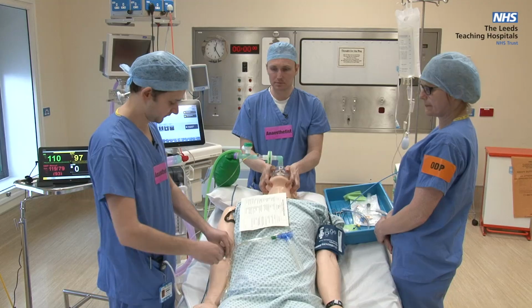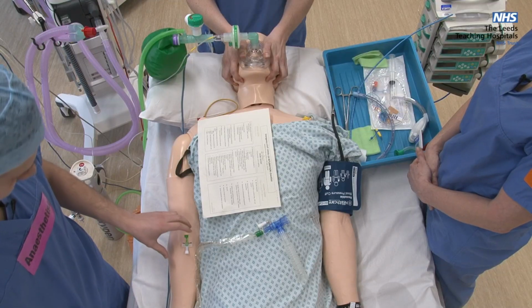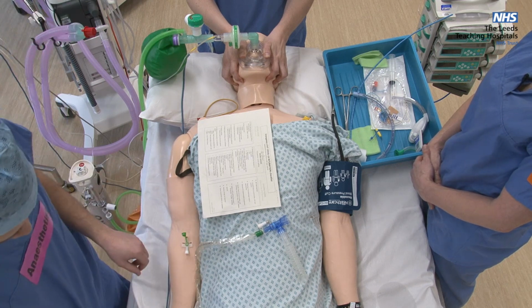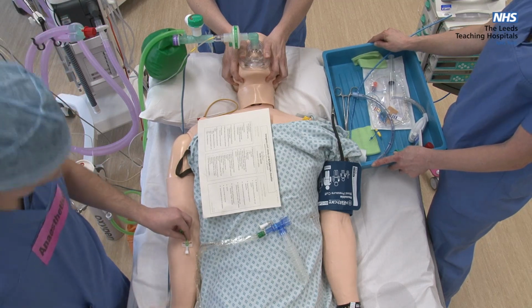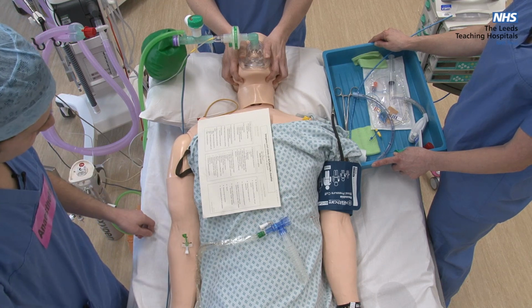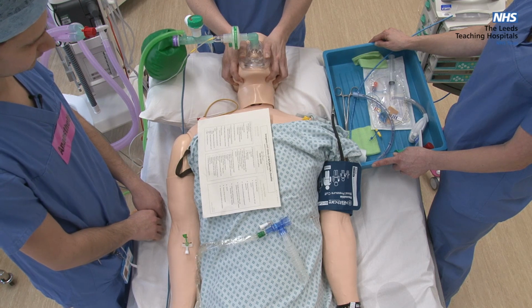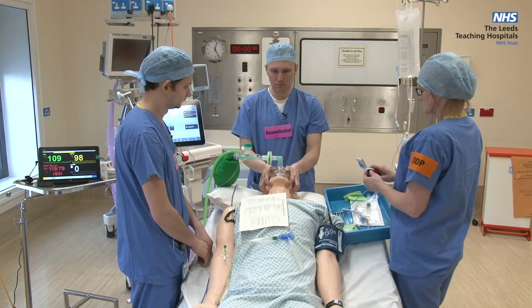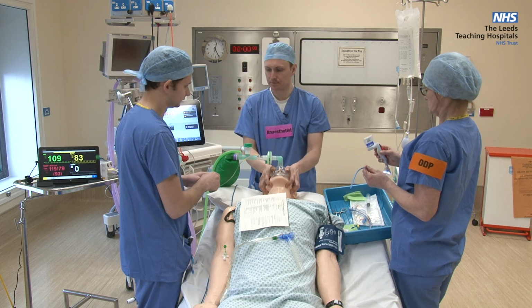Okay, drugs going in. Fentanyl 100. Ketamine 140, rocuronium 100, and a flush. Okay. Okay, so they're apneic now. And now we're at 60 seconds.